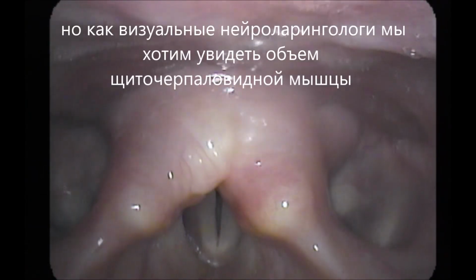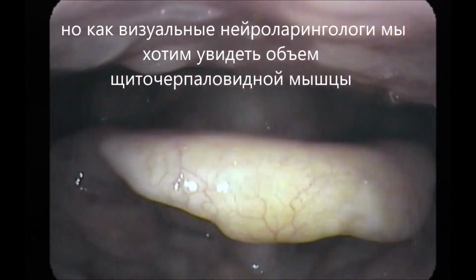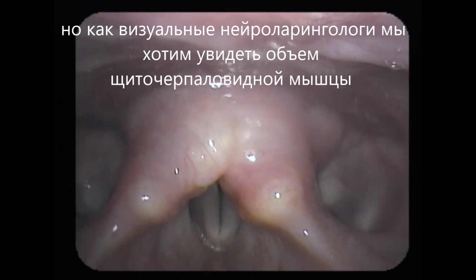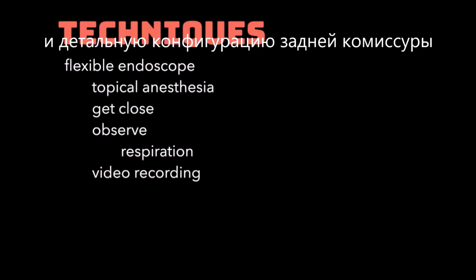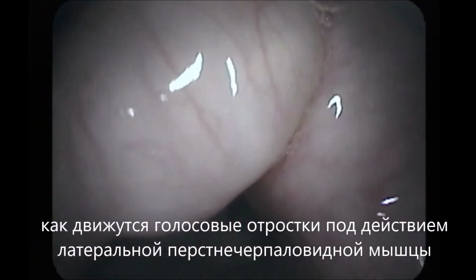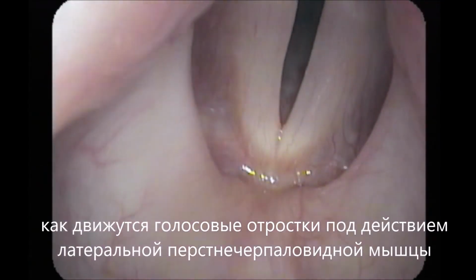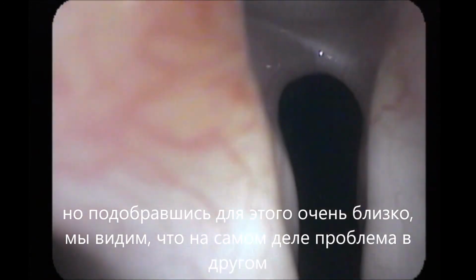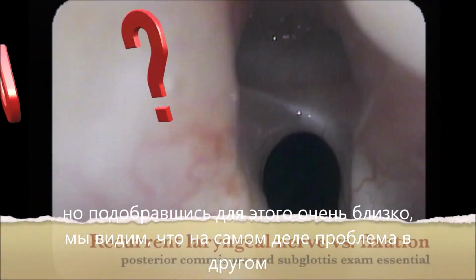As a visual neurolaryngologist, though, we want to see both the bulk of the thyroarytenoid muscle and the details of the configuration of the posterior commissure. What are the lateral cricoarytenoid muscles doing with the vocal processes? And when we get that close, we can make out a number of other problems as well. You don't really need further assessment once you see scar tissue tethering the two vocal processes together.